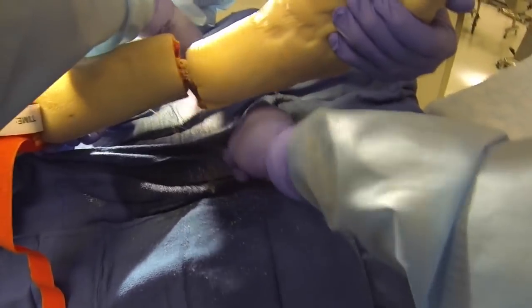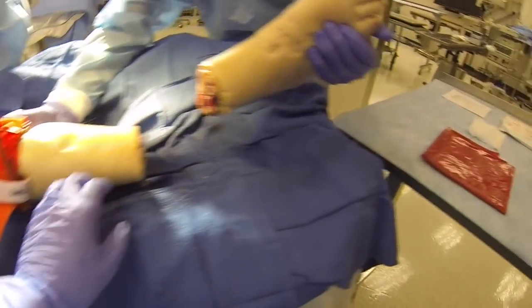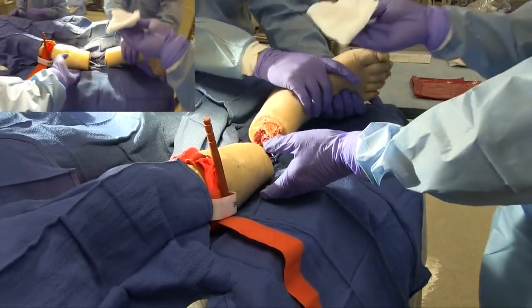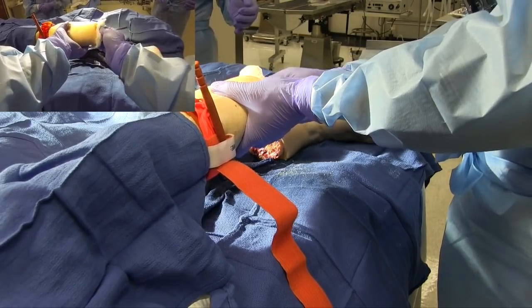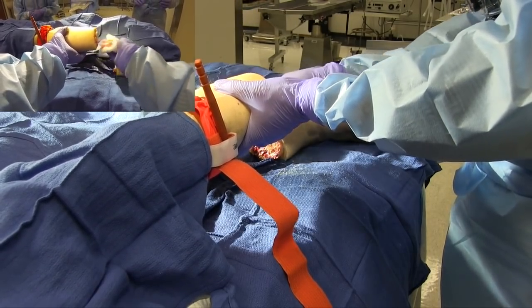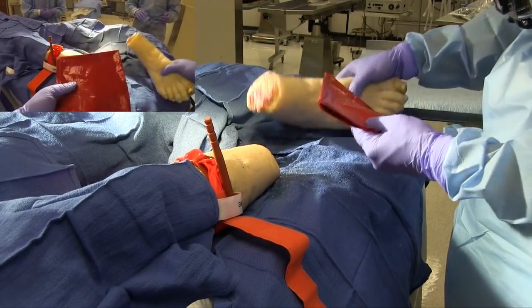Once you've done this, there may be some remaining soft tissue that you will need to incise with your 10 blade scalpel. Assess for continued bleeding and control with direct pressure. If available, bone wax can assist in stopping the bleeding from the freshly cut bone. Combat gauze is an acceptable alternative.